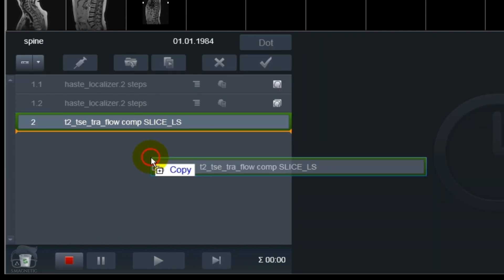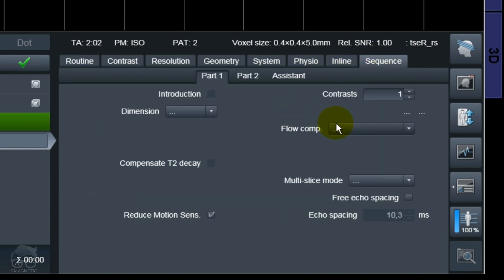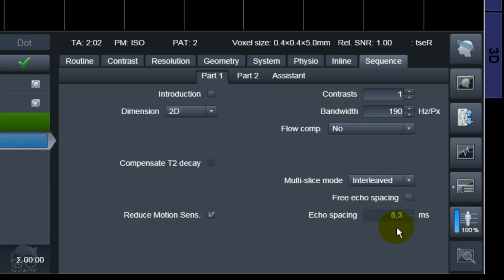We're going to do the same sequence but this time flow compensation will be off. Take note that the echo spacing is 10.3 for the sequence with flow comp on, but when I turn off the flow compensation, it's now 8.3 — so it reduced the echo spacing. One of the theories for having sharp images is that the echo spacing should be as low as possible. This is one reason to try to avoid flow compensation if you have the opportunity.